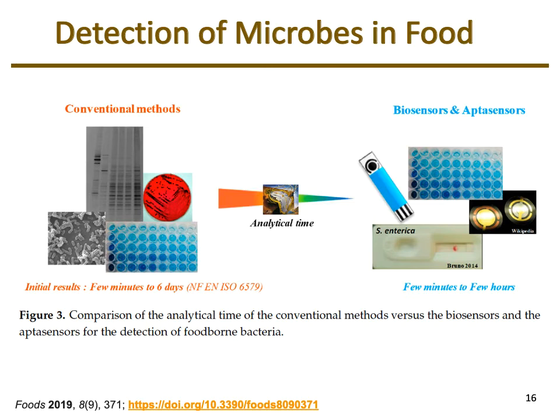With the biosensors, usually within a few minutes or a few hours, you would end up getting results. So they're much quicker. And also because of the way the methods work, a lot of times, as long as they're trained in performing that technique, they're usually kind of like a snap test, or there's a machine component to put the sample in, press run, and get a result. So there's a technical piece to it, but again, they're usually a lot easier to actually conduct than conventional methods. There's not as steep a learning curve.